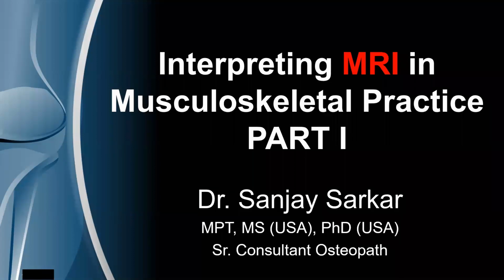conclusive evidence from MRI. Now please do remember, like yesterday, what we talked about on X-rays or radiographs, this MRI is not a first order diagnostic measure, right? Because X-ray or radiographs are the first order diagnostic measure. So don't think that you can blankly look at an MRI and see if there are any pathological abnormalities present or not.